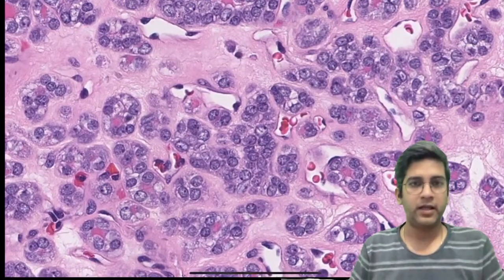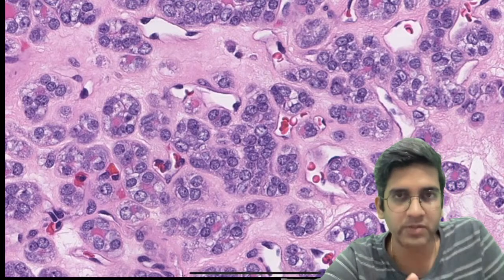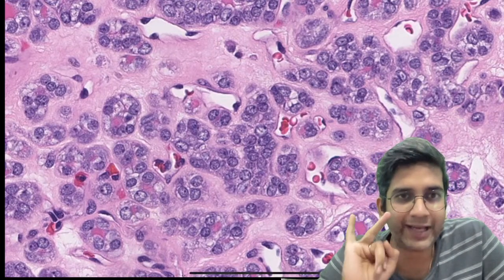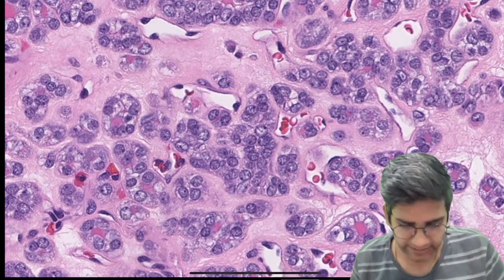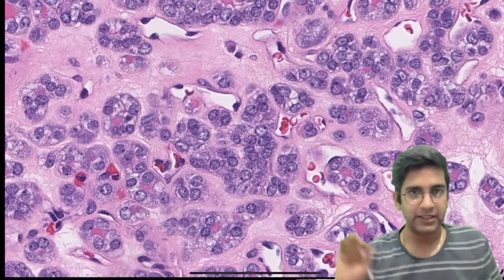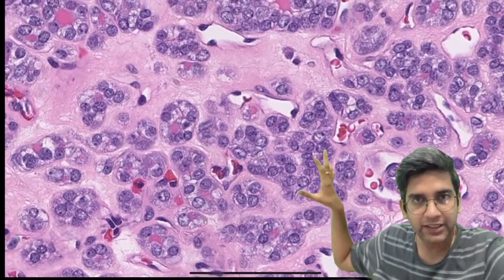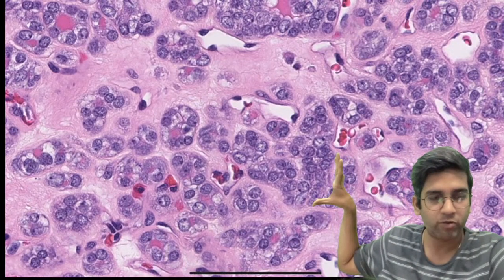Okay, look at this area. I hope it's zoomed and it's visible, right? Do you accept there is crowding and overlapping? Yes, no, maybe. If you feel it's not there, you can say clearly it's not there. In the center, I hope I can show it with my hand. In the center, do you feel this area is crowding and overlapping? Yes, no, or maybe.